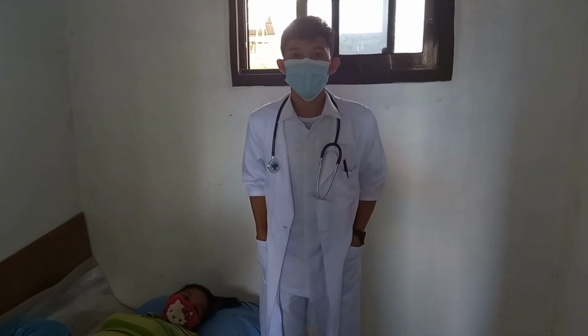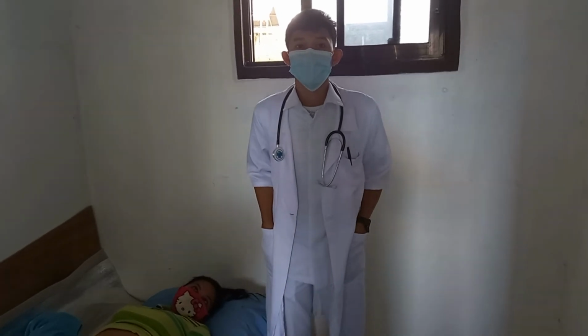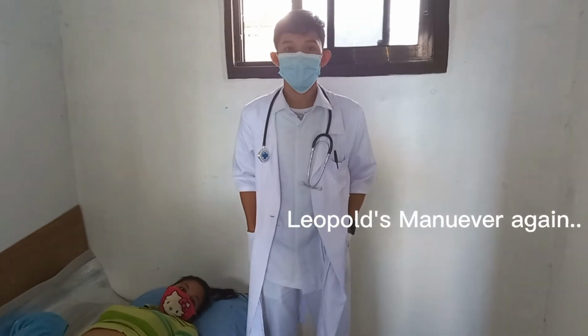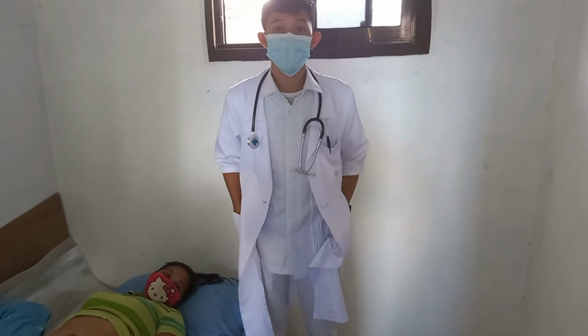And now I'm done with performing the fetal heart monitoring, and next I will do the Leopold's maneuver again. Same process as what I've done earlier.